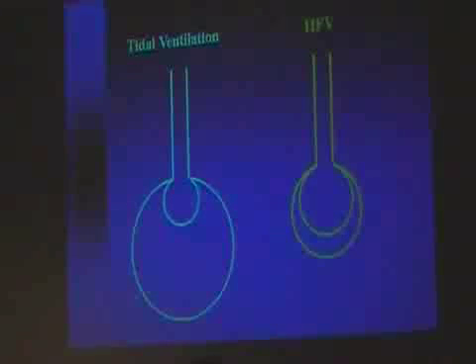During high-frequency ventilation, we're vibrating the lung. We're going to hold that lung at, again, the optimal mean airway pressure, but then we're just going to vibrate the lung. We're not going to have that opening and closing and opening and closing of the alveoli nearly to the extent that we do during conventional ventilation.